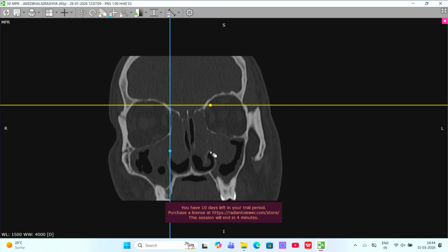See, he has a complete whiteout with the frontal sinus untouched. So his previous work is not adequately done. So first we have to finish whatever remaining surgical part is needed to give access. See, if you don't operate on this patient, how will the topical steroid penetrate into the frontal sinus?